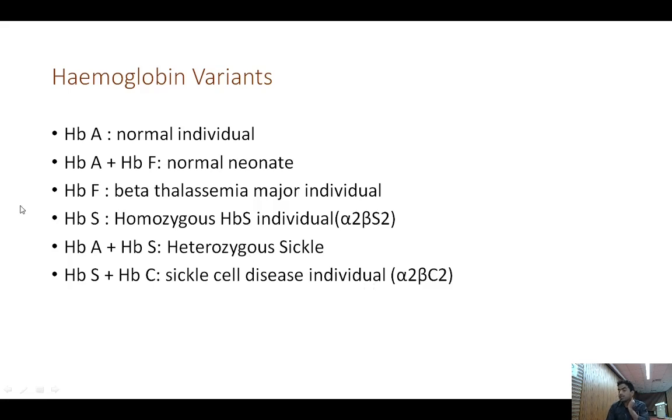For your practical exam purpose, I'm telling you, mainly they will come as charts. There will be given some pattern, and some band will be marked. You will have to write what proteins are present there, or some abnormal pattern will be given, and you will write what may be the condition. For some you have to write the exact answer, like if there is a sharp band or sharp spike in the gamma region, you will have to write multiple myeloma. But if there is an increase in the gamma region, we will give the normal and abnormal pattern both. We'll try to give that if it is something which is not a very obvious disease.